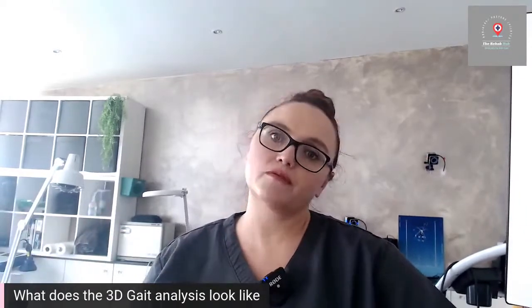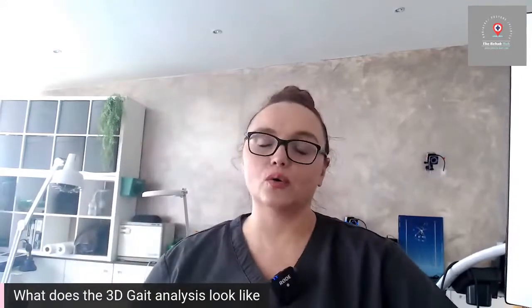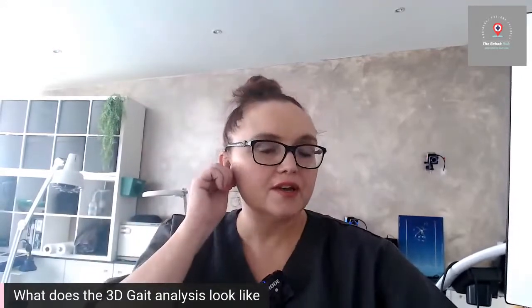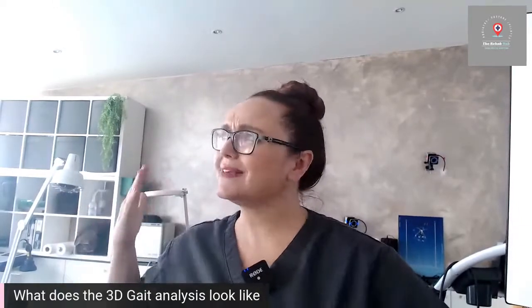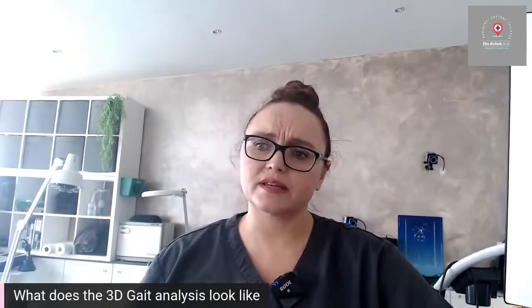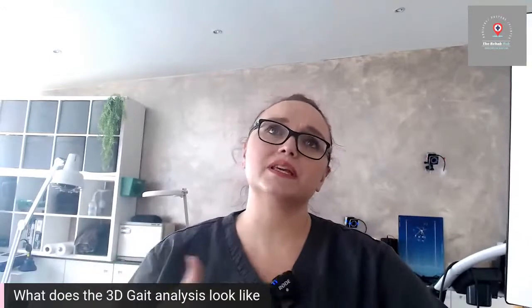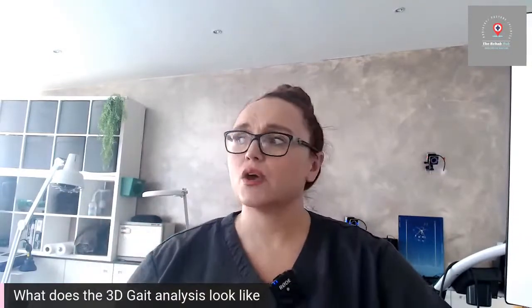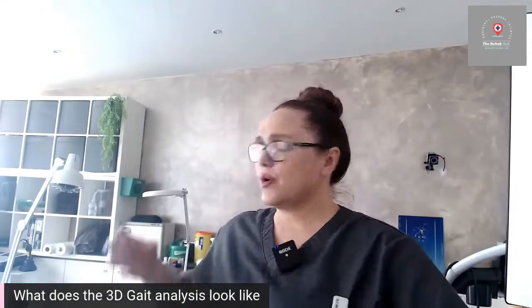Rehab, proper rehab for that area, but not just looking at that site of pain, looking at the body as a whole and how you ambulate. So if you are in pain, definitely do reach out. But also, say you're wanting to do a 5K and you've never run before and you're a wee bit concerned about getting injuries, then it's ideal for that. It's almost like you're preempting, right? Like, where am I weak? Where do I need to strengthen up? It's fantastic for that.